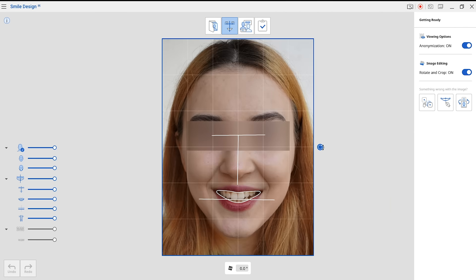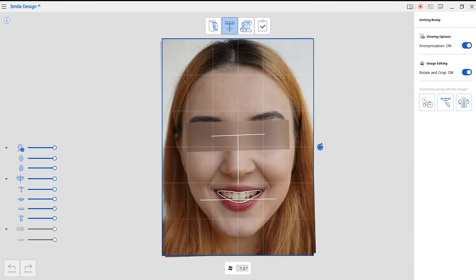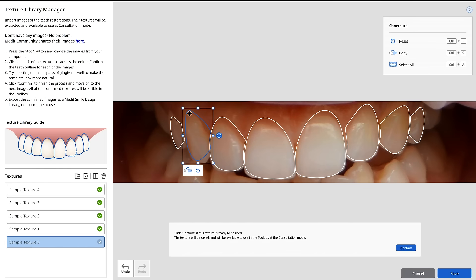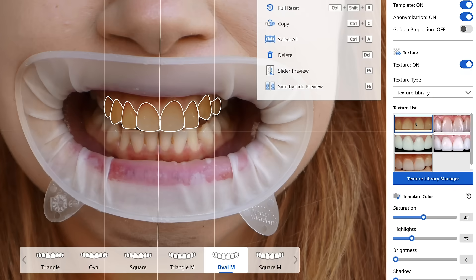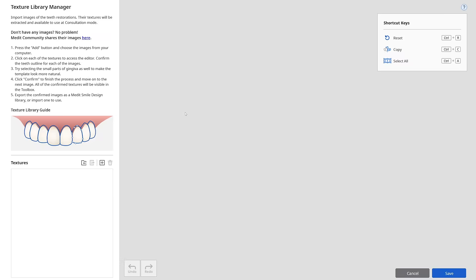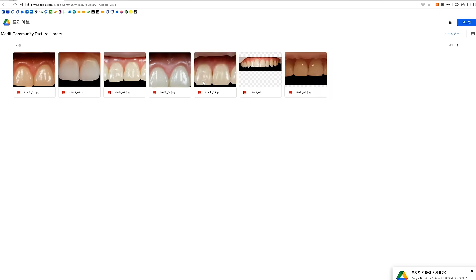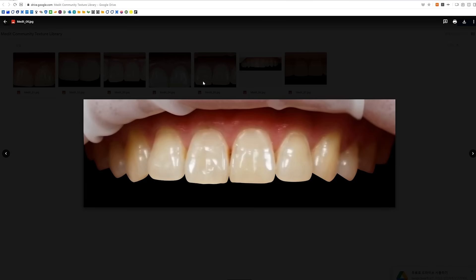In Smile Design, we focus on providing some cool new functions for you to step up your consultation game. So first of all, so many of you asked us to provide a rotation tool, so of course we did. My favorite addition to Smile Design this time is the Texture Library. You have a restoration library you're proud of? Use it! We'll export the texture for you so that you can utilize it for consulting your patients. Don't have those images? No problem — go to this link and check out if other users have uploaded something to share with the Medit community.